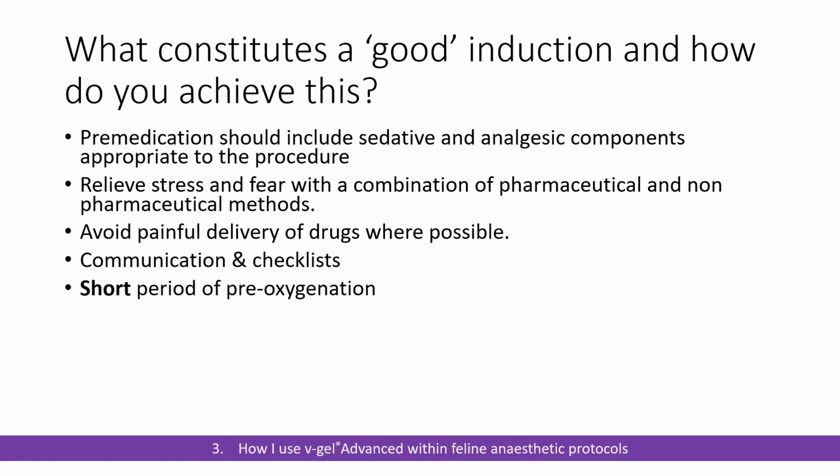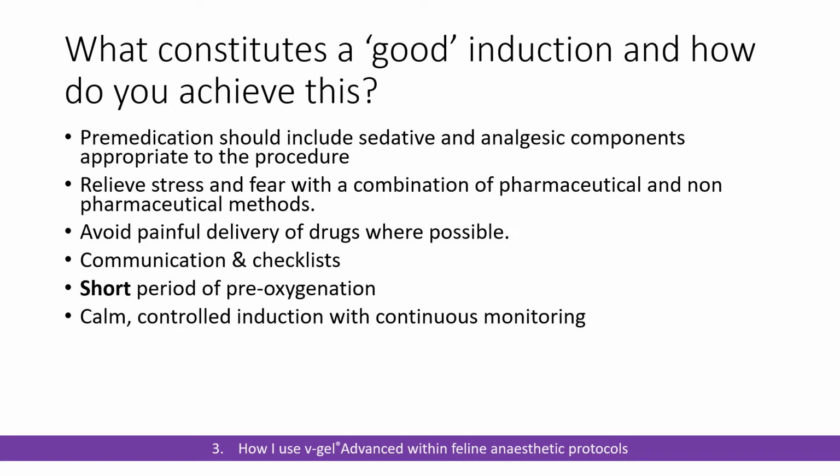Think about a short period of pre-oxygenation as we've discussed, and then you want a calm, controlled induction with continuous monitoring where your team is concentrating on your patient and not chatting about other things. So it's absolute concentration on that induction procedure.